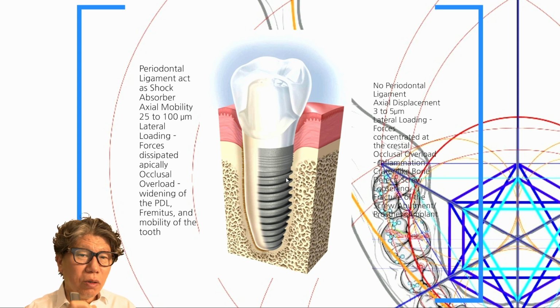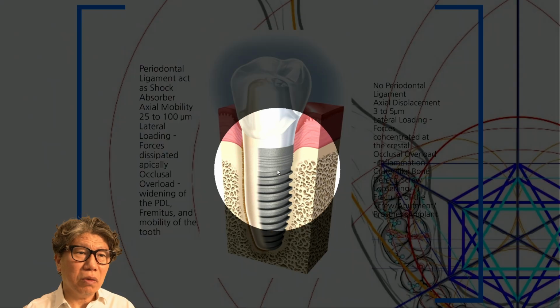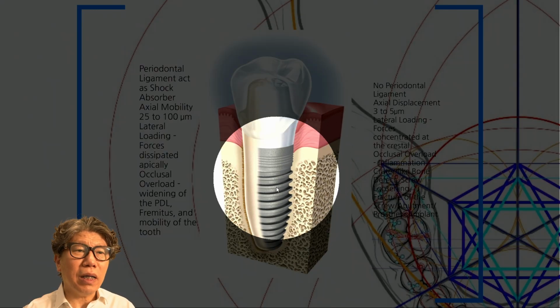So if you look at the surgical drill for our implants, you can often see rusting from the laser marking area. In fact, almost all implant drills rust. By pondering this a bit more, you can understand why implants are made with titanium material.